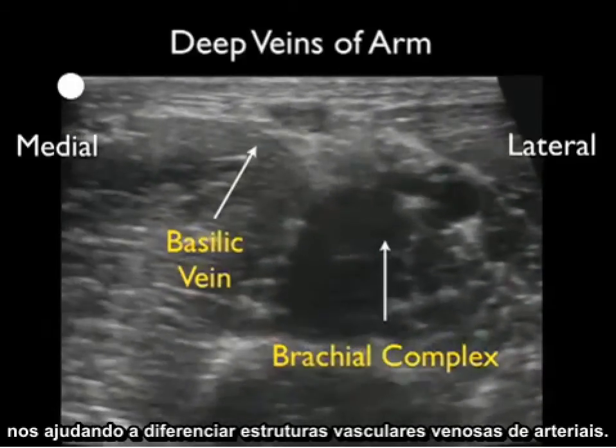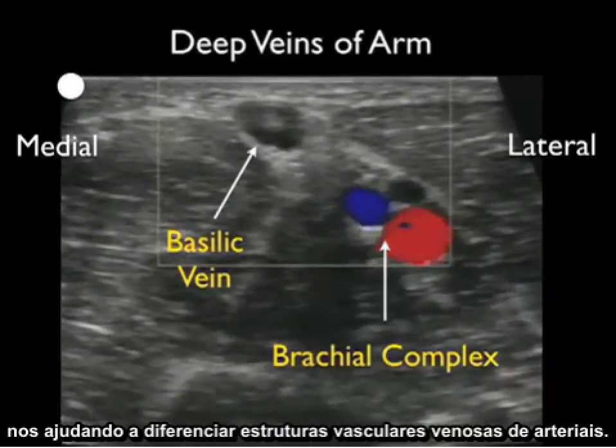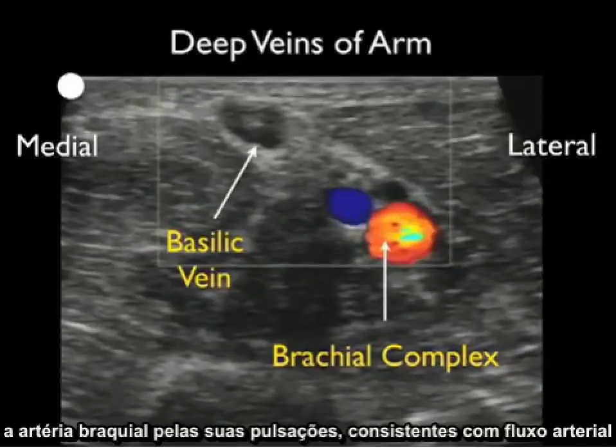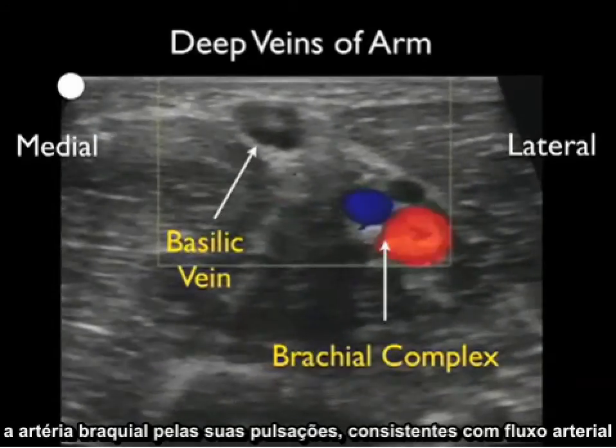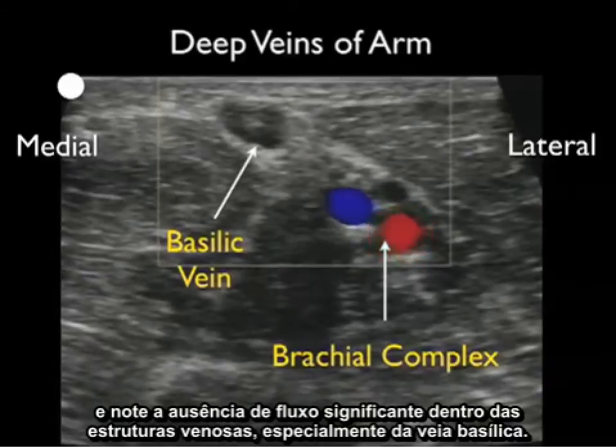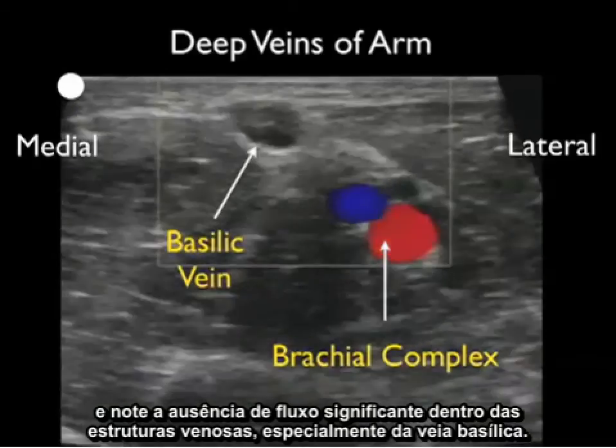This compression helps us differentiate venous from arterial vascular structures. Applying Doppler flow, we can again differentiate the brachial artery by its pulsations consistent with arterial flow, and note the lack of significant flow within the venous structures, specifically the basilic vein.